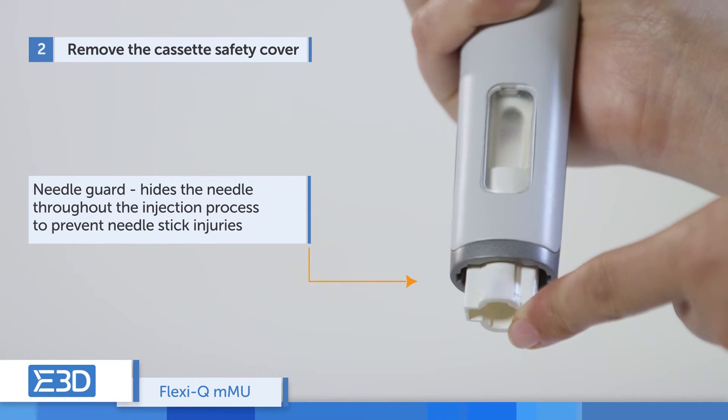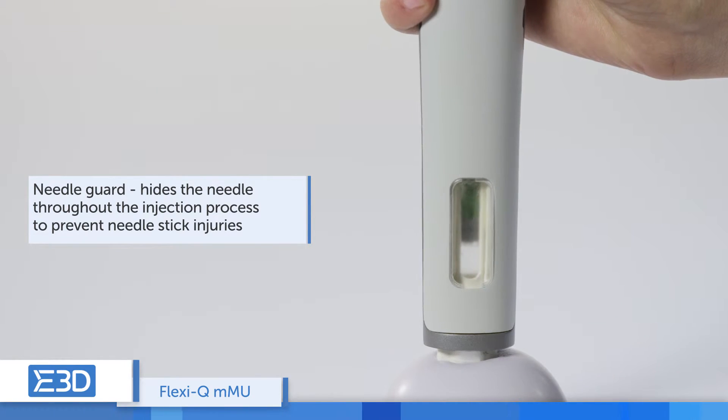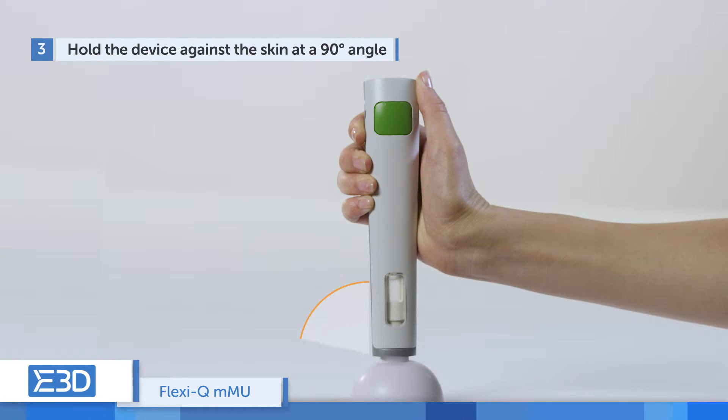The needle guard hides the needle throughout the entire injection process and prevents needle stick injuries. Hold the device against the skin at a 90-degree angle.